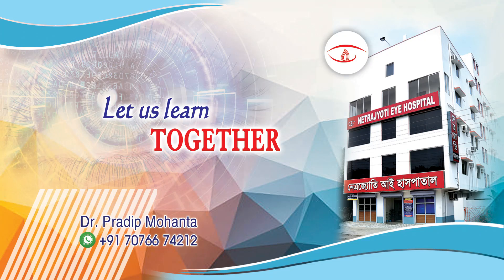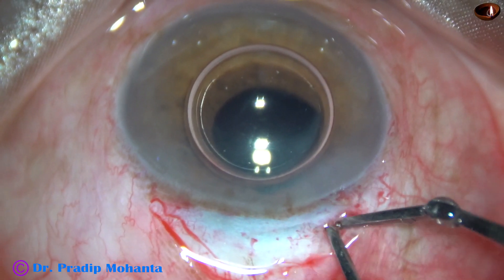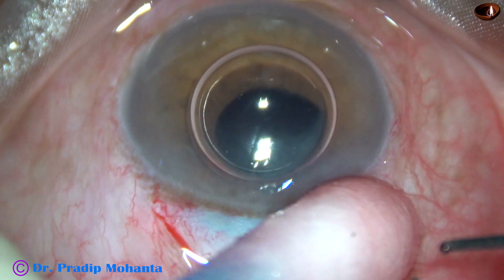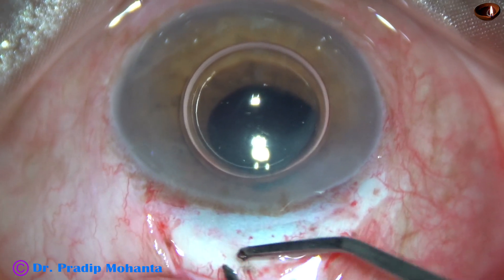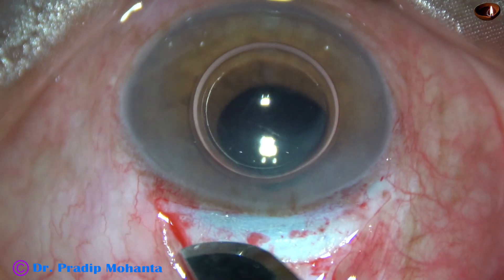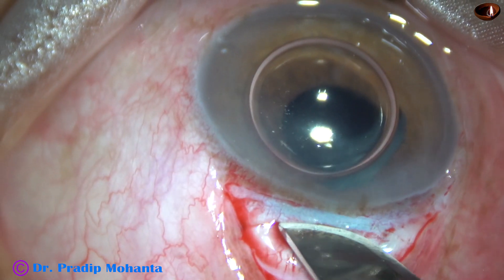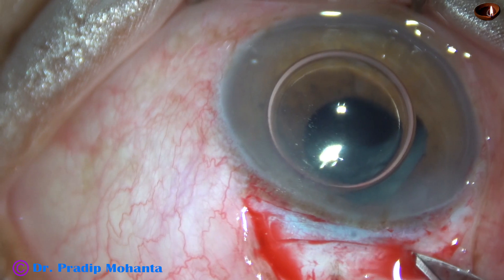Friends, welcome to my workplace at Ranagahat, West Bengal, India. In this video, we are going to watch implantation of a posterior iris claw intraocular lens, which is a PMMA lens. The capsular bag has come off while aspirating cortex after nucleus management in this case. But the anterior vitreous face is intact, and now we are going to manage this case with the help of iris claw intraocular lens.